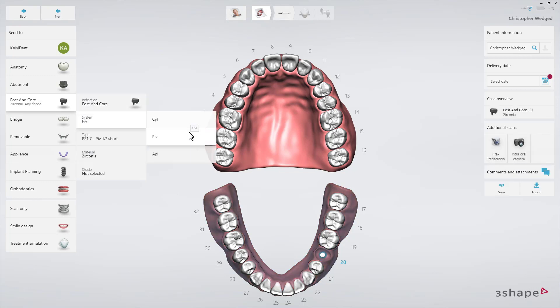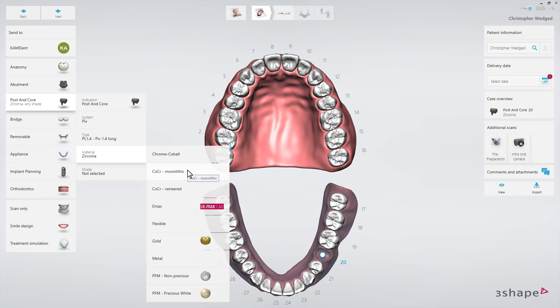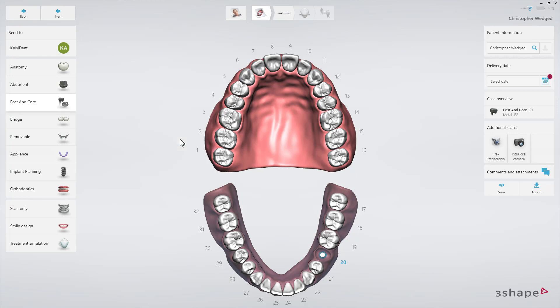Then select the system from the system drop-down list and the type that you will use for your preparation. At the end, select the desired material. Finally, set the delivery date by clicking the Delivery Date button.